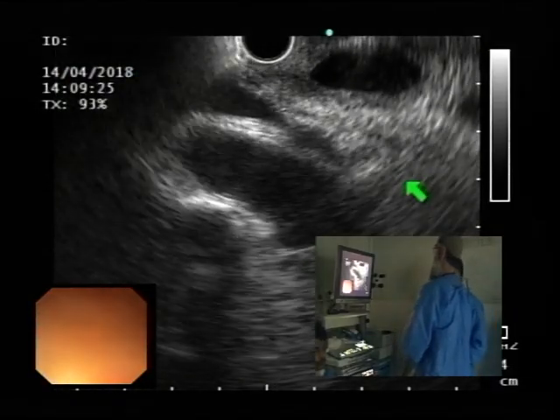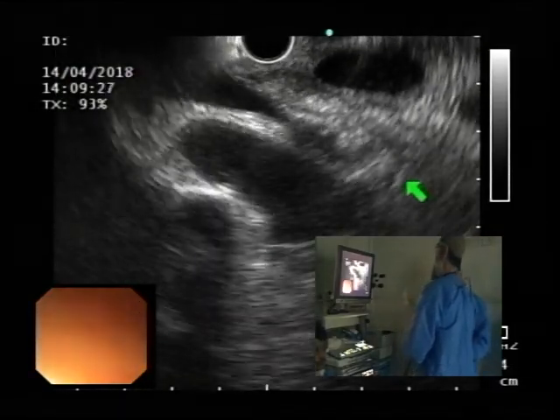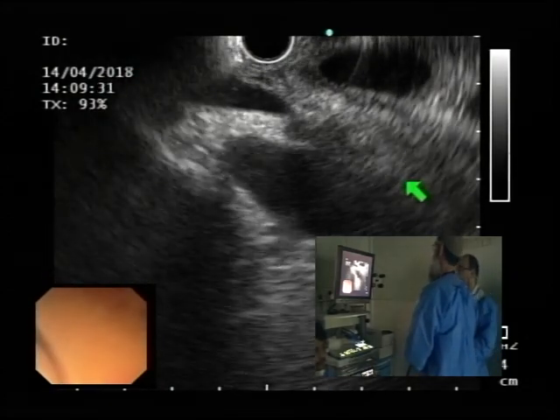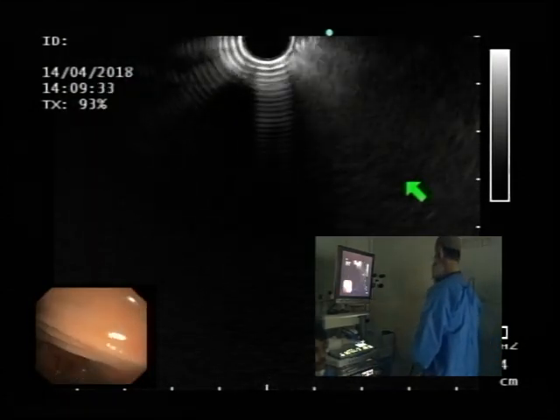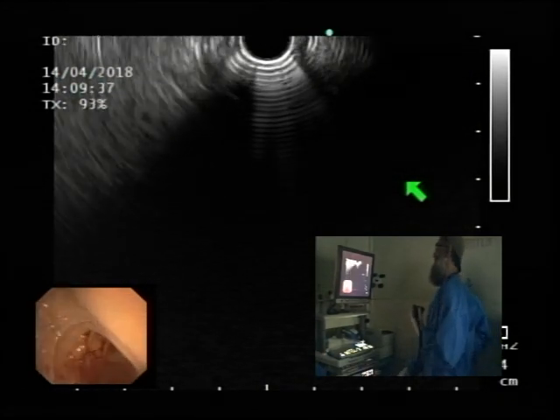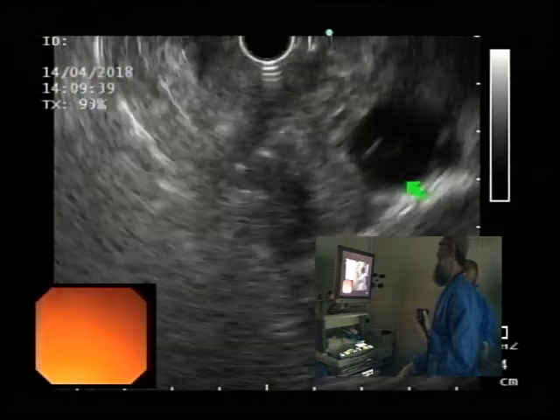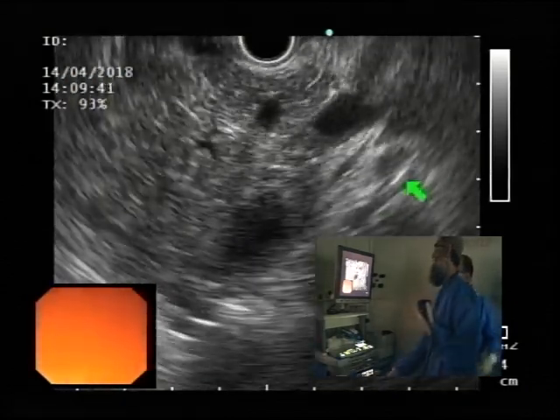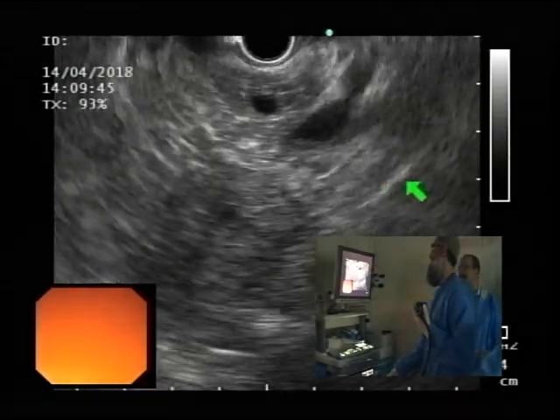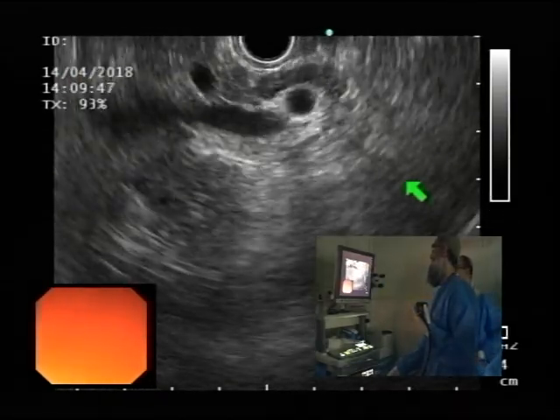Take it. That's nice. You got the body views were great. I mean the stomach views. So चने पे निकाल लें because we don't want to unnecessarily delay the case. I did not see anything obvious in the liver on my limited exam. Yeah, you just followed the PDF, by the way. That was nice. And that's going into the head.